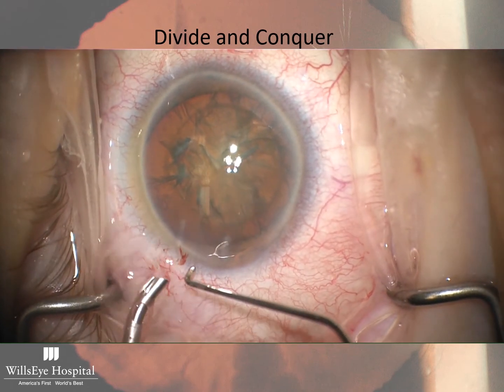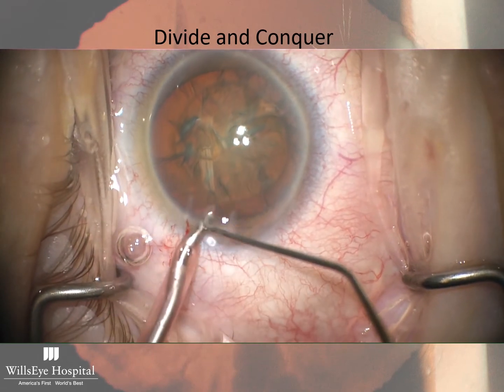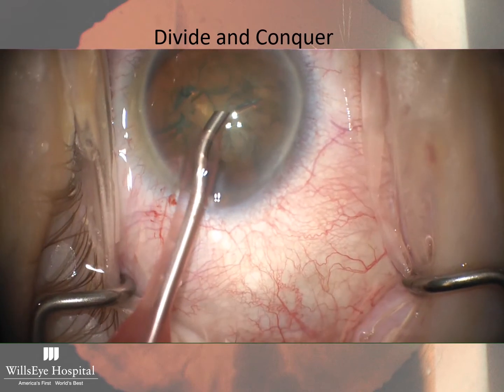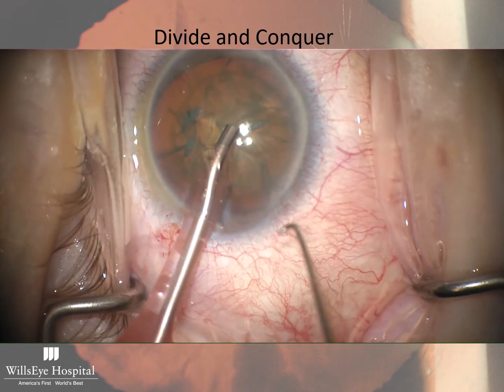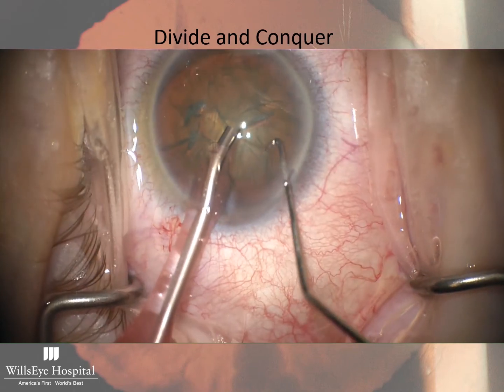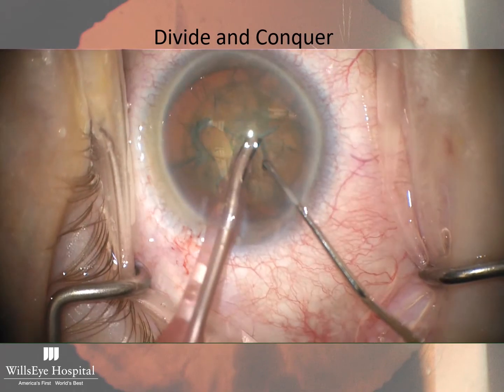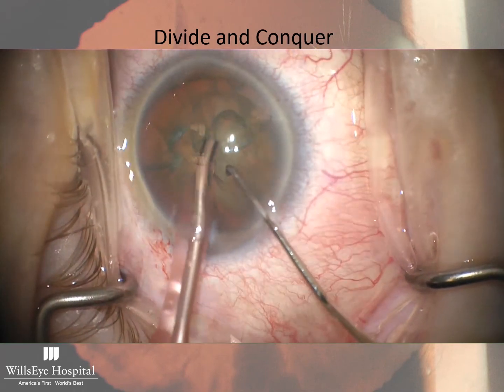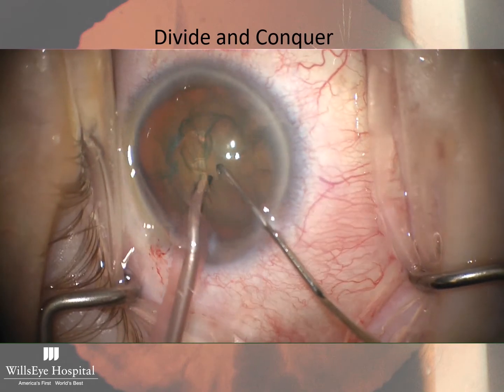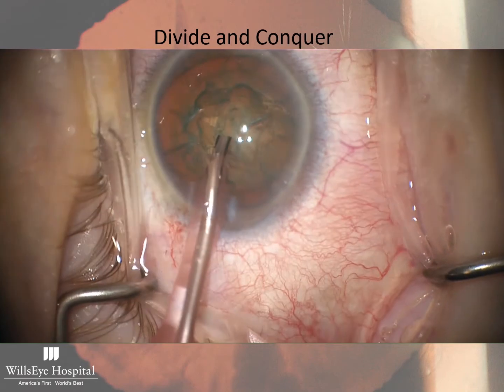So I'm using my second instrument to lift up the external edge of the wound to get my instrument in. You see how it goes in very nicely there. And then I'm going to stabilize the eye with my second instrument, although as people are learning, oftentimes they use two hands for the phaco. Here I'm just on a higher vacuum setting, clearing up the cortical material. It doesn't matter if you groove through cortical material at all. You want to get it out of the way.